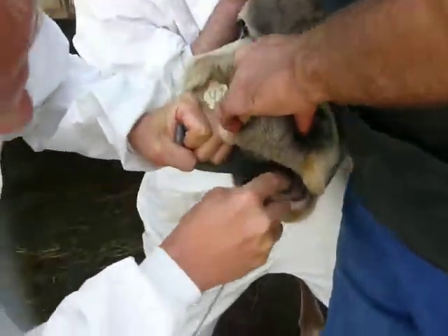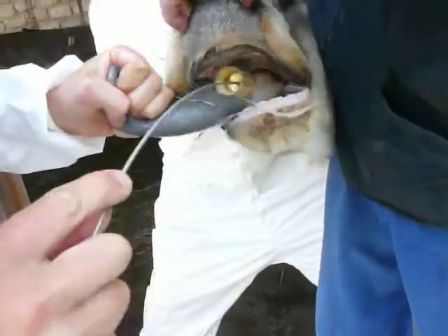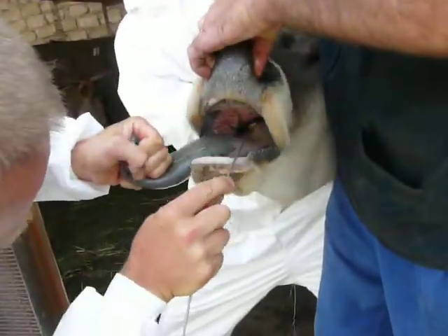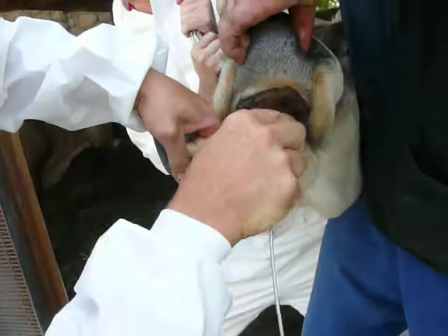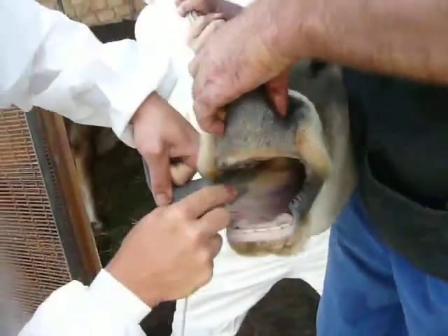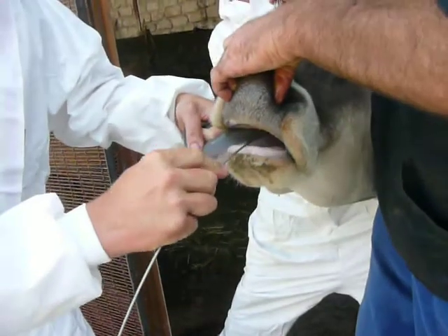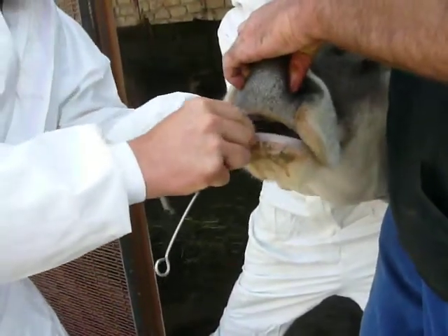And then gently push over the back of the tongue. Now we are there — the Oro-Pharyngeal region. Let the animal swallow it itself.